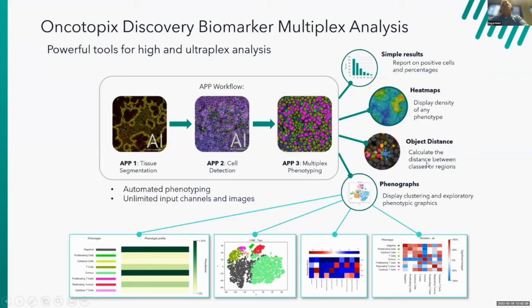neighborhood analyses. And in Visiopharm, we have now developed some very cool interactive bidirectional plots so that if I click on a point in a graph, I can see those objects in the image and vice versa. And this really gives me ways of being able to do some amazing quality control over the tools that we're using, and to give me a way of exploring data that isn't found in most pieces of software.